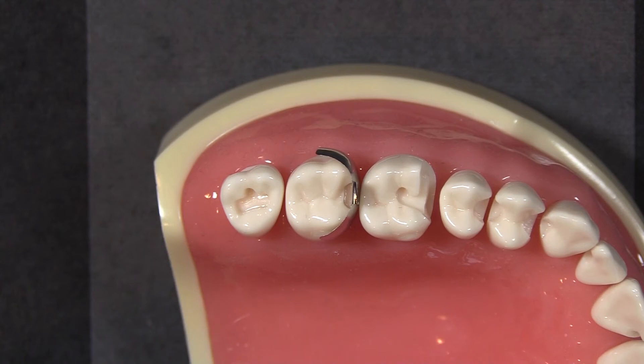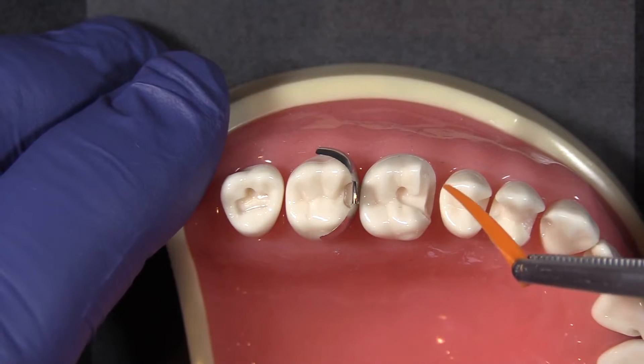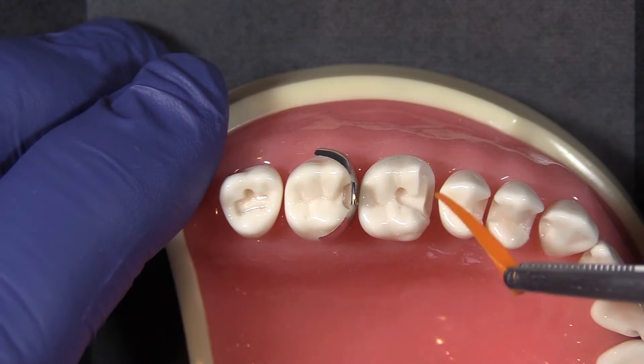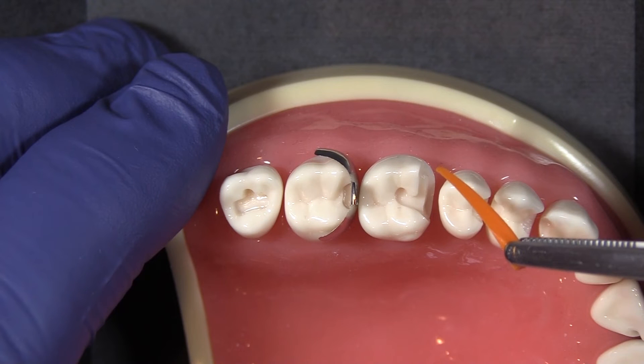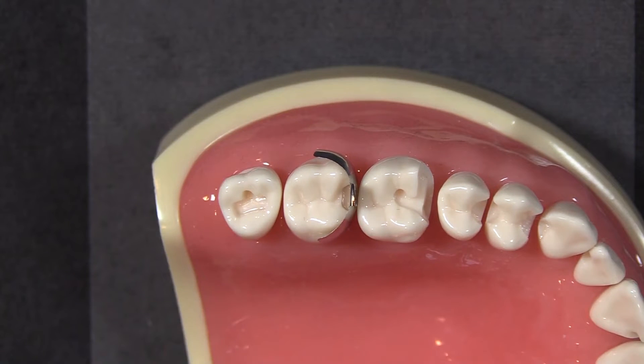It really doesn't matter which side you're placing the wedge from — you can place it from the buccal or lingual. In this case, because it is fairly evenly distributed, either works. If you were doing a really wide MOD or MOB, you would wedge from the buccal because of the placement of the restoration itself — you want to support the band with the wedge.